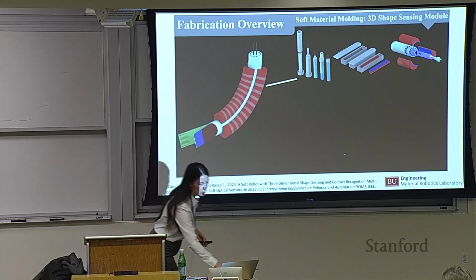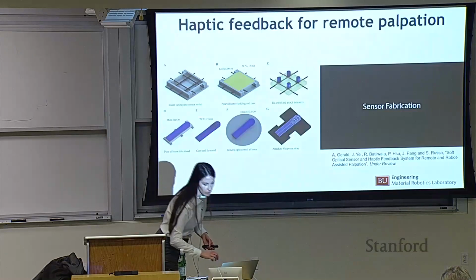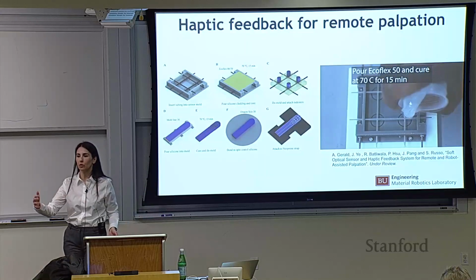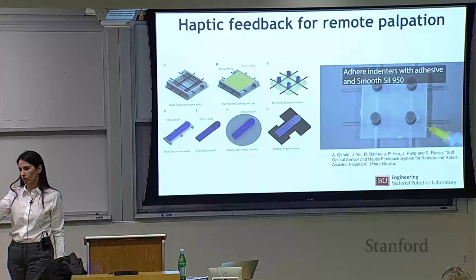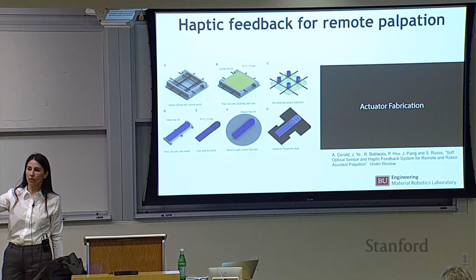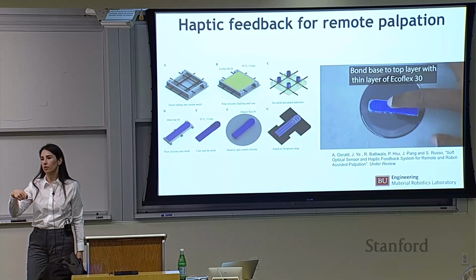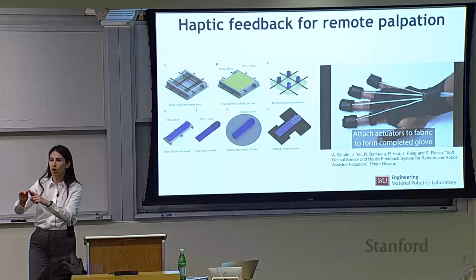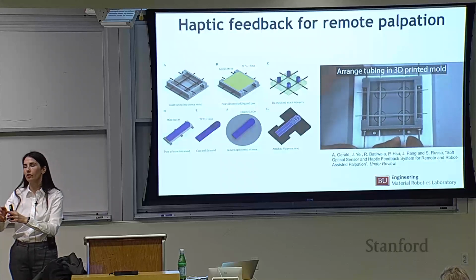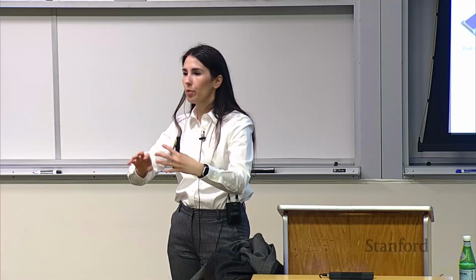We have also been able to prove that we can use this technology with microtubings, such as these ones over here. We're still able to guide the light through. These tubings are quite large, but we've recently been able to demonstrate that with really tiny tubings, like 100 or 200 micron medical tubing, you can still achieve these capabilities of soft optical sensors. So one thing you need to consider with an instrument like the da Vinci is that you want to scale the sensor down as much as possible to integrate it on the gripper of the system. It's definitely possible because this is an optical sensor, so there's only light passing through, no current, no voltage, no temperature, and so on. So yes, it would be definitely interesting to look at that, and it could be possible.